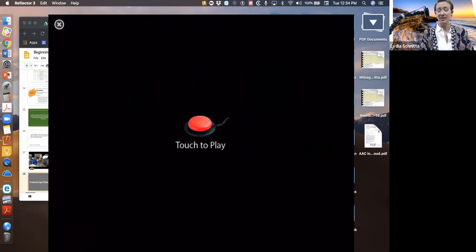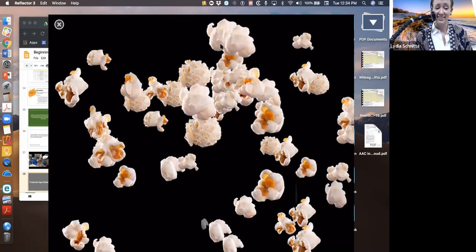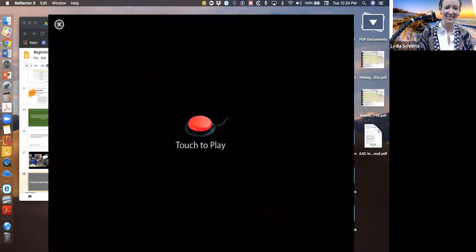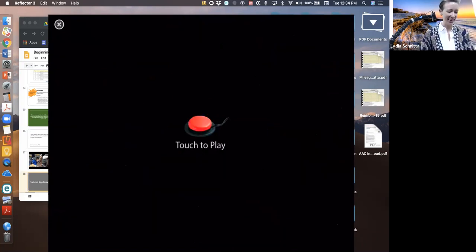Touch to play. Which is like this. And so I'm going to switch going here. Oops, I'm in the wrong mode, guys. Touch to play. Okay, so I have to make sure that I'm in space and enter. So it's sending space key and enter. Touch to play. You can change it so it doesn't prompt you so much, but here's what it looks like. Pretty exciting. And there's a little bit of a delay for you guys, but it did stop on my iPad. So pretty exciting. I'll just show you a different one.